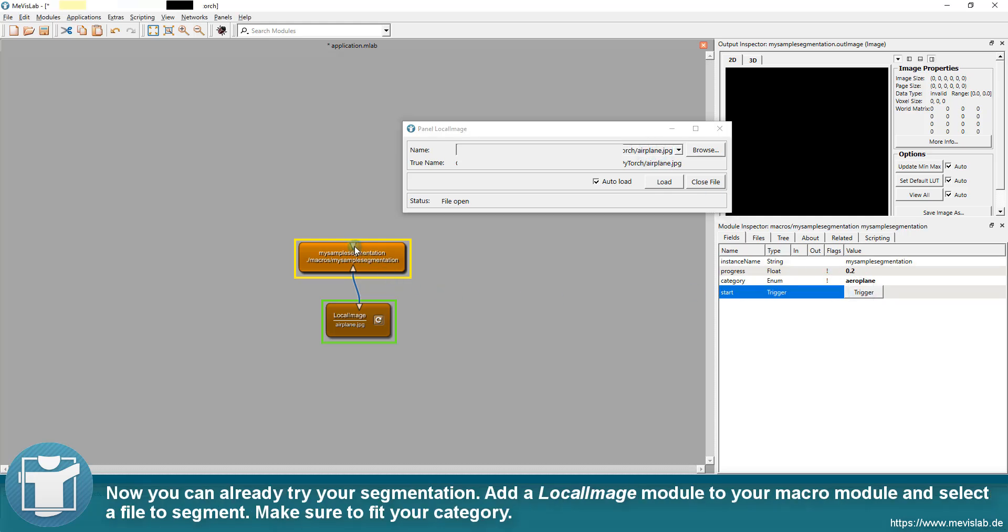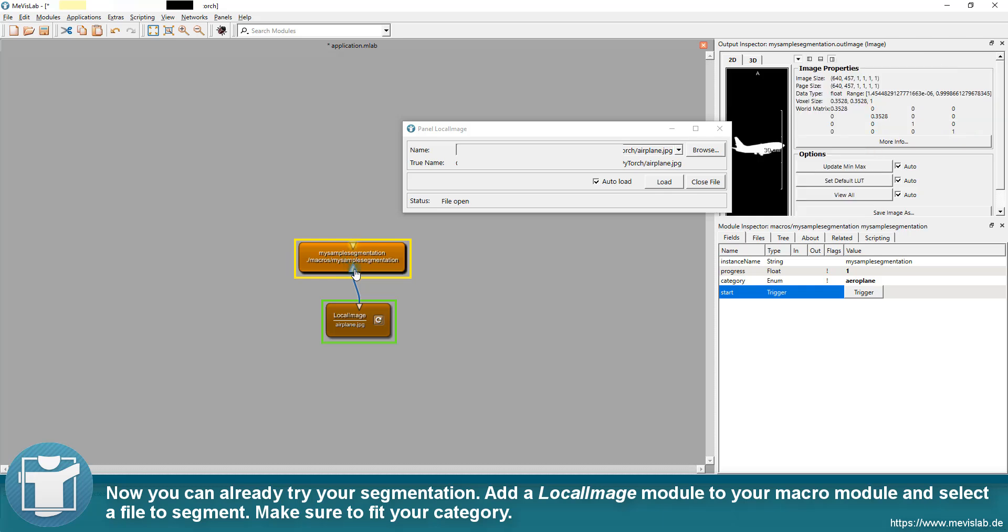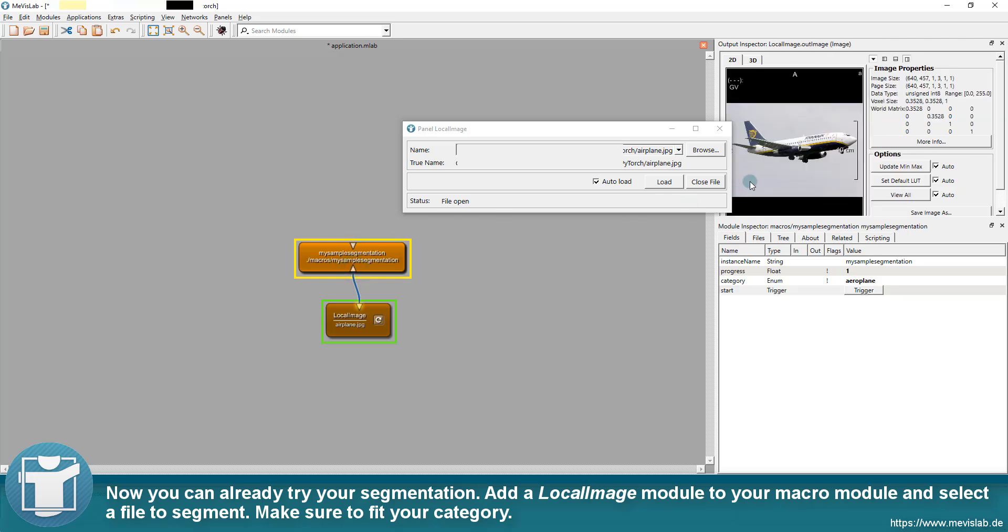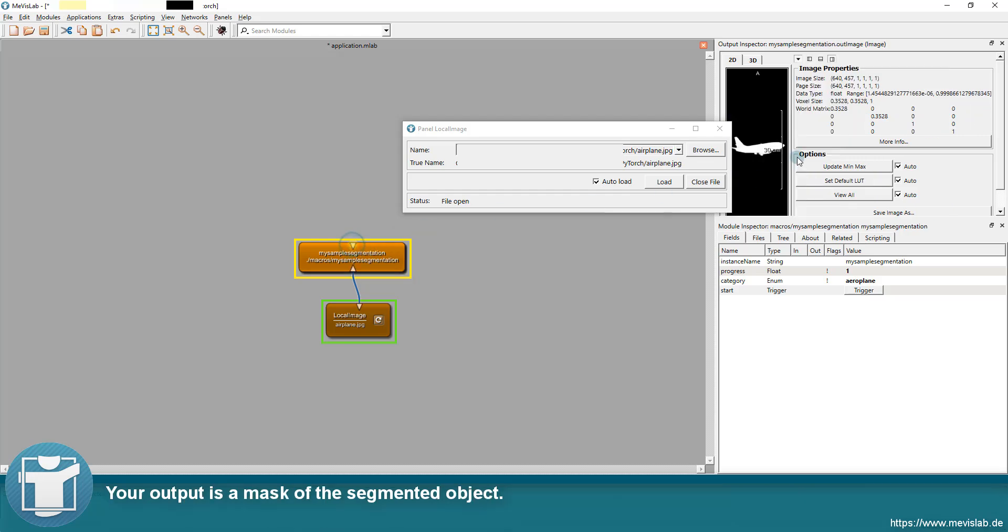Add a local image module to your macro module and select a file to segment. Make sure to fit your category. Your output is a mask of the segmented object.